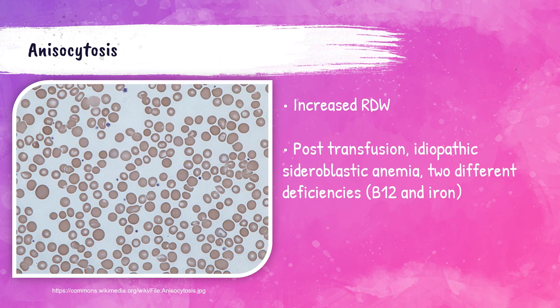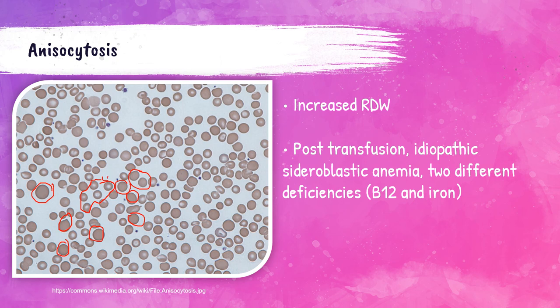Please check out my video on red blood cell indices where I discuss RDW. If we look at this peripheral blood smear picture on the left-hand side, you can see this is somebody with a dimorphic population of red blood cells and an increased RDW, and we would be calling anisocytosis on this patient. There are some normal looking red blood cells I would consider very normocytic, but then look at these — these are macrocytes. So we have a lot of macrocytes and then some normocytes, and it's very clearly a dimorphic population.